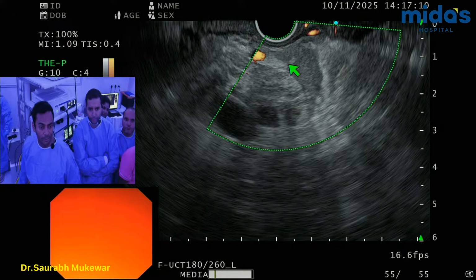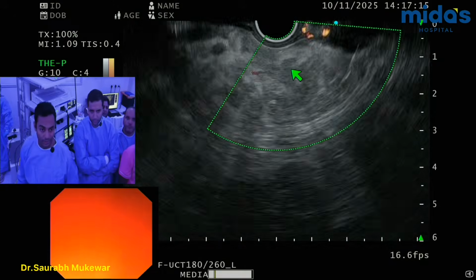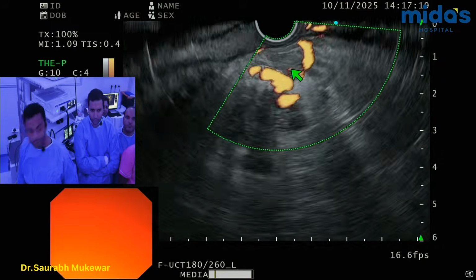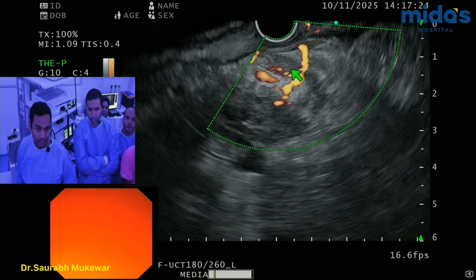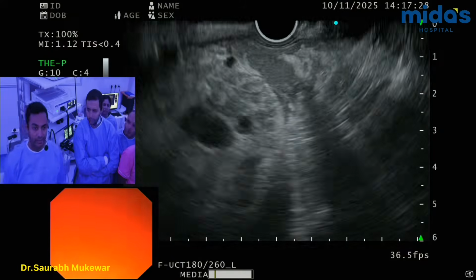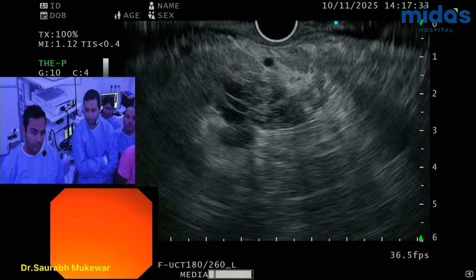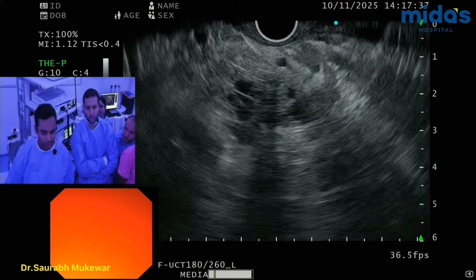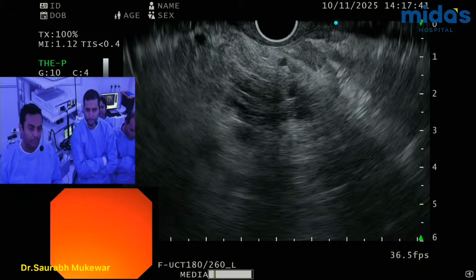Okay. Well, as long as it's contained, I think it's okay. There was a bit of a... which wasn't taking Doppler. But anyway, we'll just want to make sure you monitor him for a while. Some oozing. It tends to be a vascular lesion and there is a little bit of a clot. It's okay, that much we can live with. Usually don't encounter, but I suppose it's a small lesion, there's limited room for moving, bunch of vessels around. It's fine.